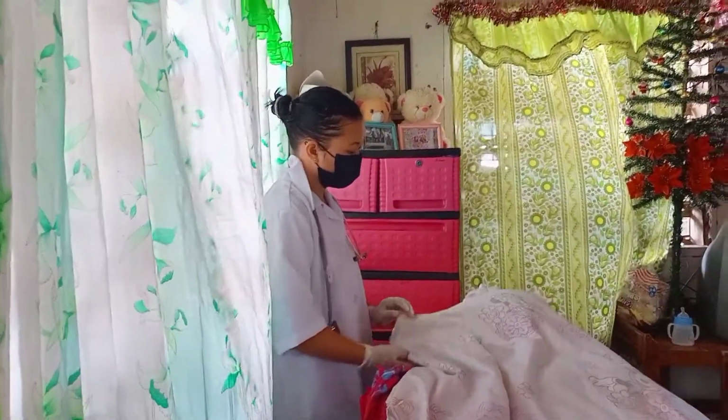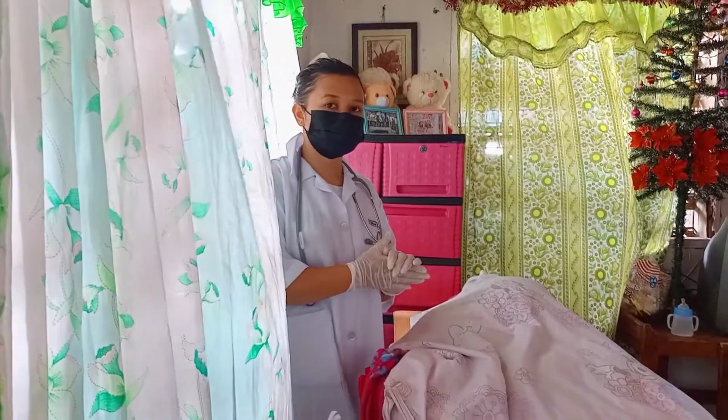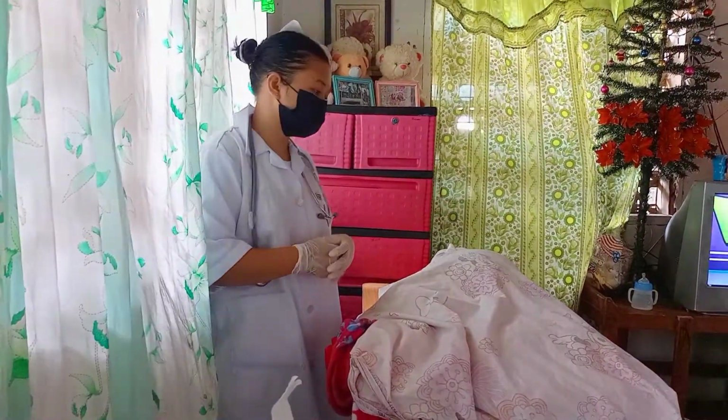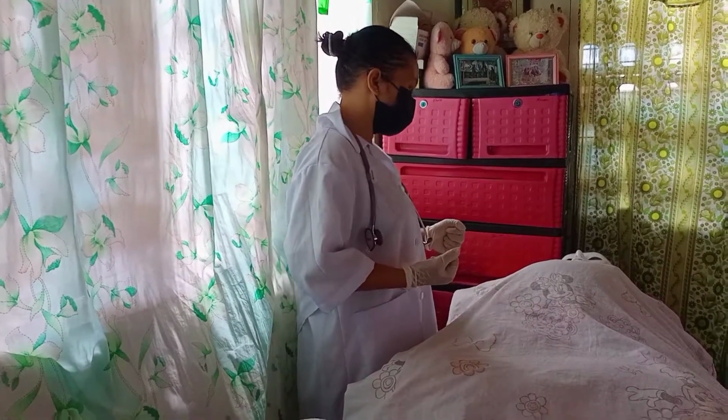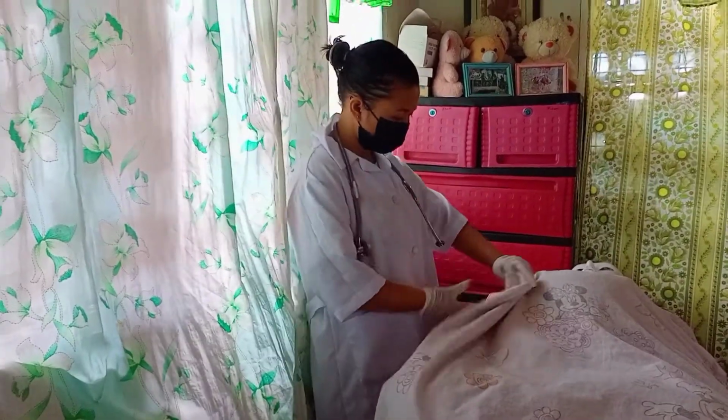So, ma'am, sabihan niyo na lang po ako if naka-defecate na po kayo, ma'am. Dito lang po ako sa labas po, ma'am. Pwede niyo po ako tawagin, ma'am. Thank you po, ma'am. Next is to remove the bed pad. So, ma'am, i-remove ko na po ang bed pad po, ma'am, ha?